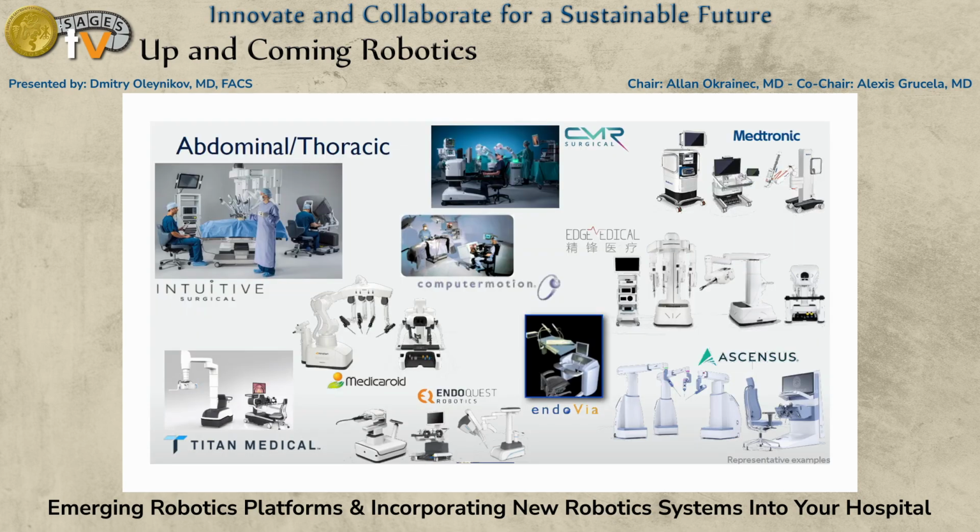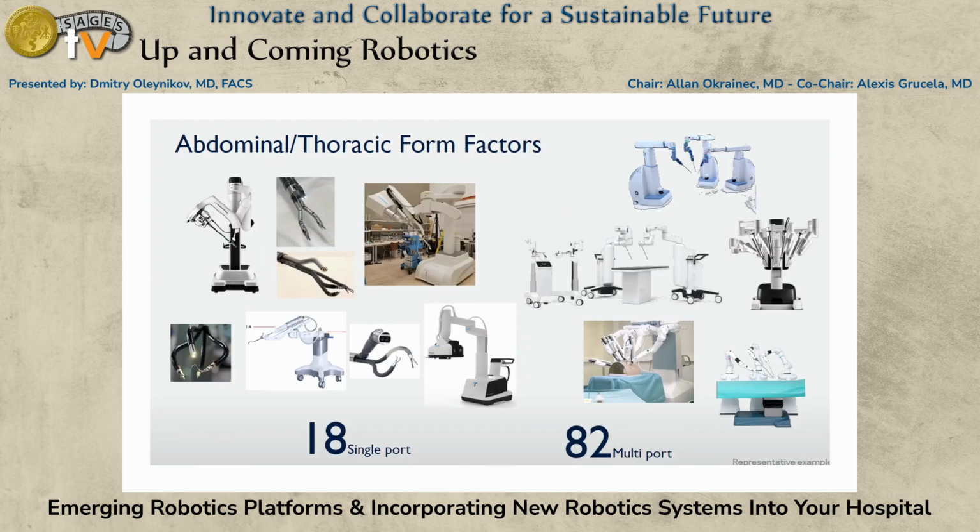So we're going to catch up, and I'm going to show you why, I think. When you look at all of these different robotic systems, I would love to go through each and every one of them, but there's just not enough time. There are so many, but this is a representative sample. We've heard a little bit about CMR already, and obviously Hugo there on the right, and there are many others here, Titan, Senhance and others. What we see is the need to take the straight stick laparoscopic approach and turn it into a digital, robotically enhanced approach. And that's what each of these systems is seeking to do.